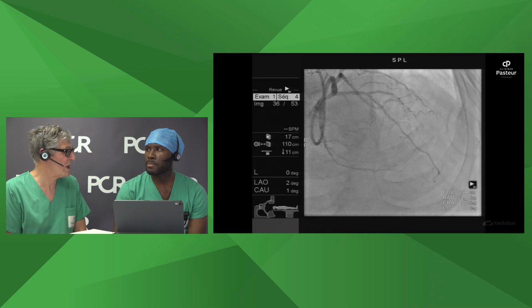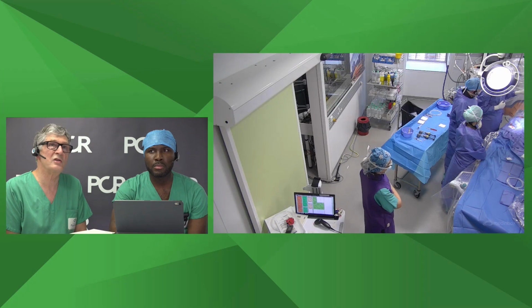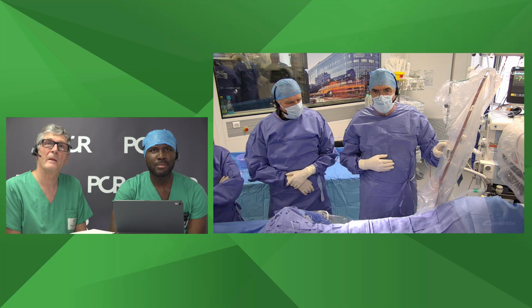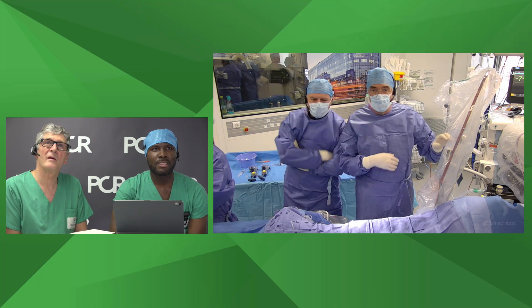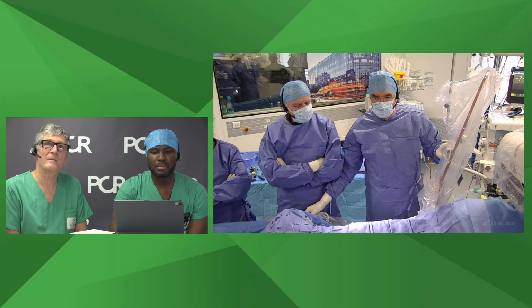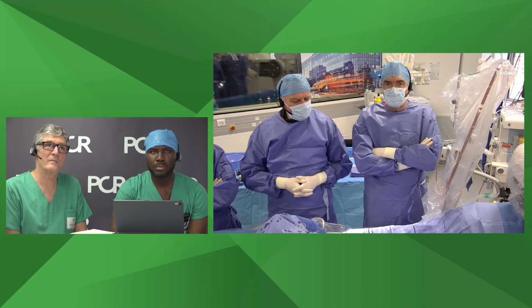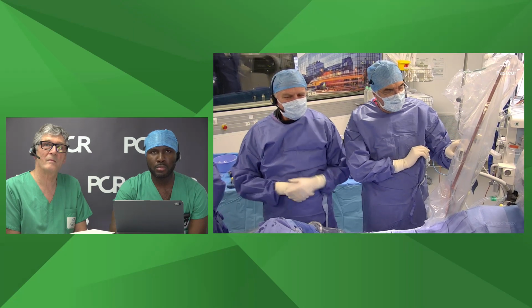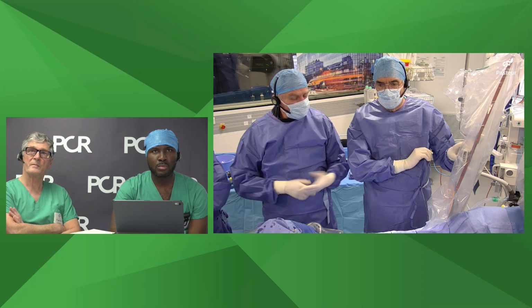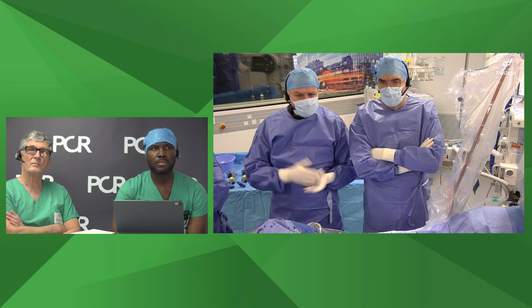So maybe we can move to the cath lab and ask Jean and Bruno which kind of strategy they will apply to this complex case. Jean? Hello Bruno? Thierry, we are very pleased to welcome you in the Clinique Pasteur cath lab. So it's quite an interesting case because it's a 1,1,0 bifurcation of the distal left main, as you mentioned, with the specificity of this large dominant left circumflex, which has no disease at the beginning. Yeah Jean, that's the main issue and discussion here.